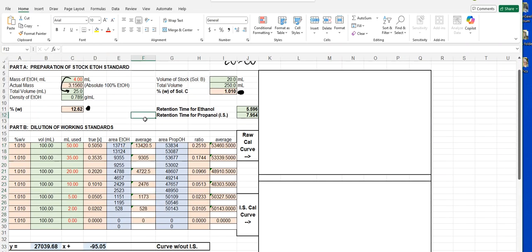And I'll show you a trick that I do. It might not be the fastest. It might not work for you. You might hate it. You might know of a different method better. But I'm going to show you what I do just because I think it works for me. And I've never been let down by this method. So we need to do a cal curve with data that is separated.